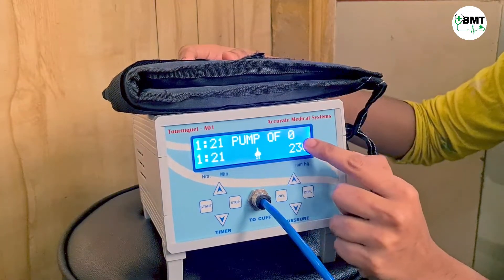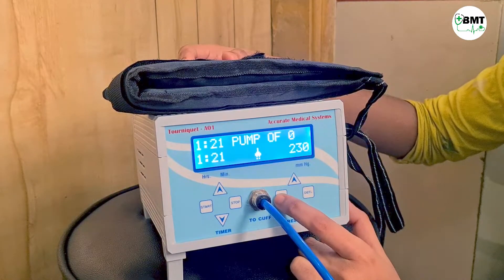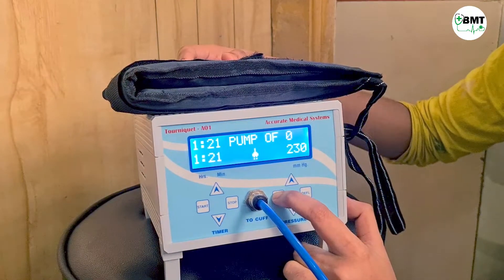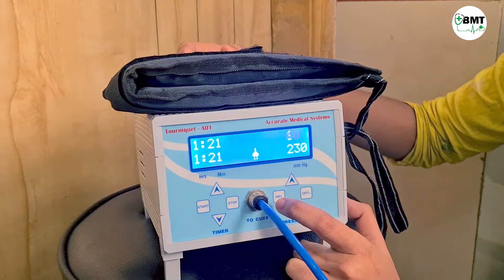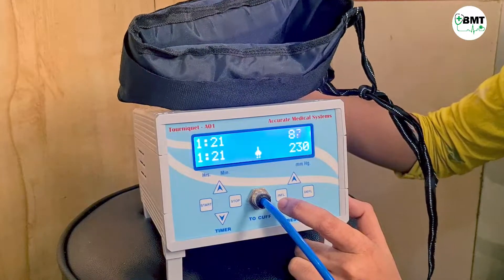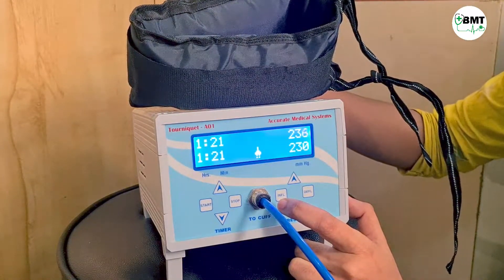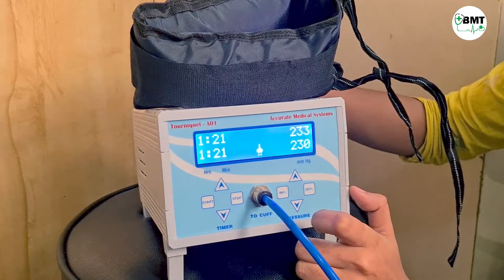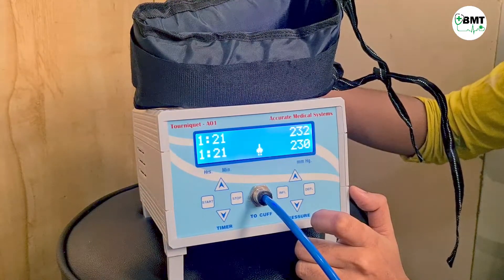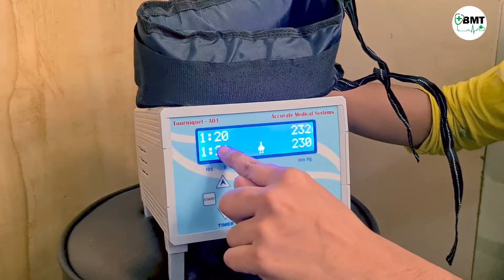Currently there is no pressure in the cuff, so it is showing zero pressure. Now if I press inflate, it will show the cuff pressure. Once it reaches the set pressure, it starts adjusting the pressure to maintain that set pressure.